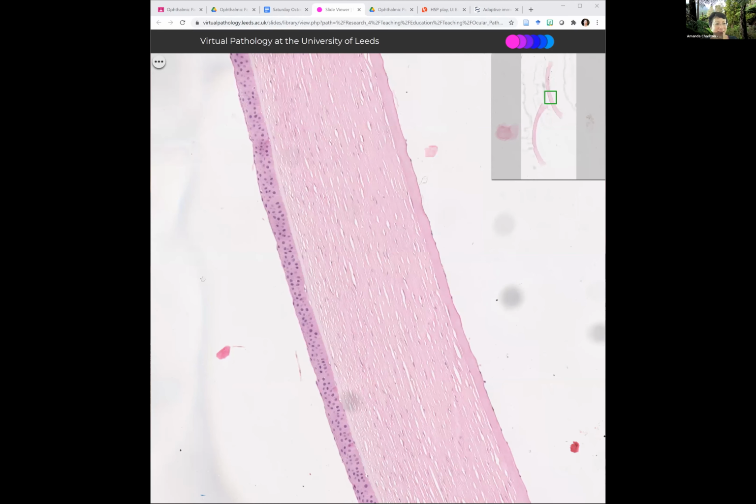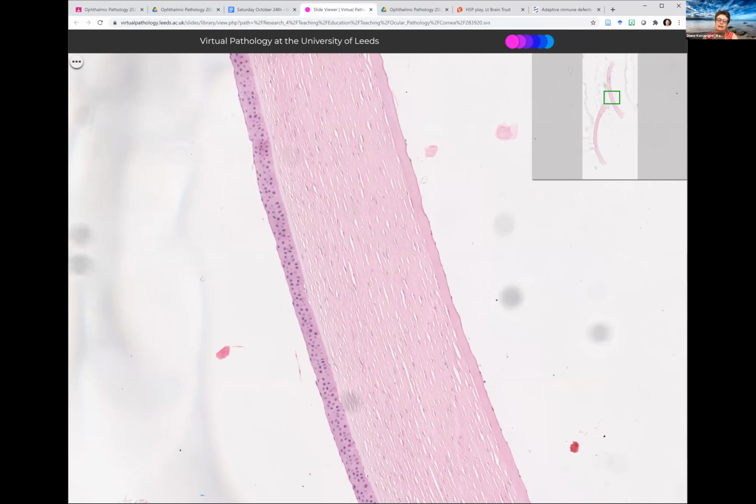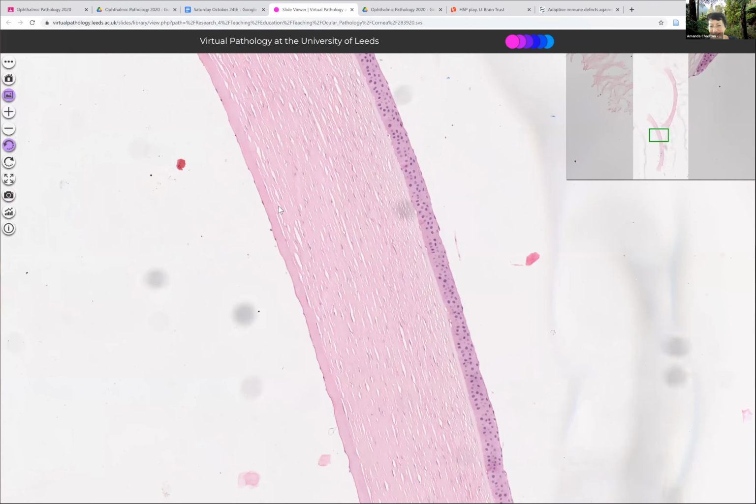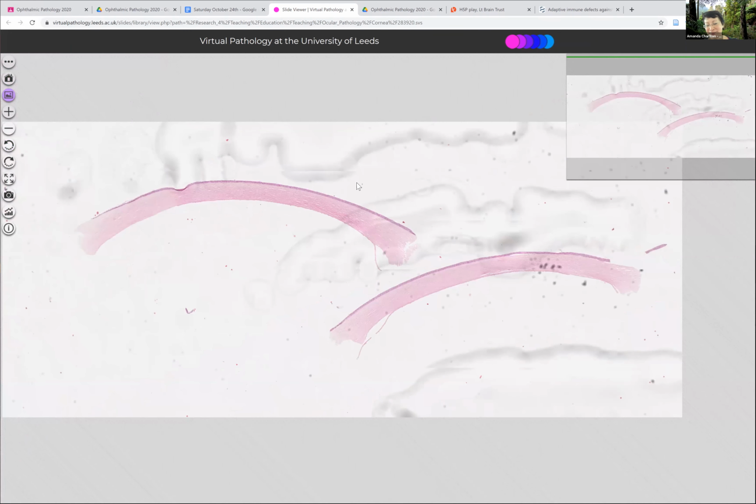These things come up a lot better on a special stain, easier to show. We haven't talked about special stains, but what special stain in particular were you thinking of, Amanda? I really like PAS for my membranes. That's right. So all my corneas normally come with a PAS stain. Yes, I'm trying to get that done, but it's very hard to get that to stick anyway.